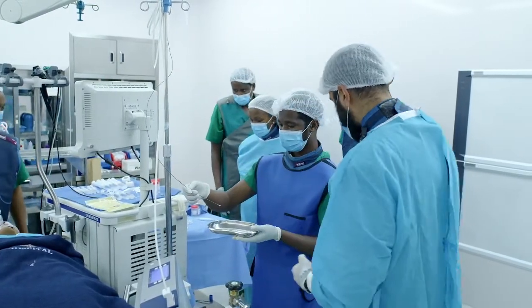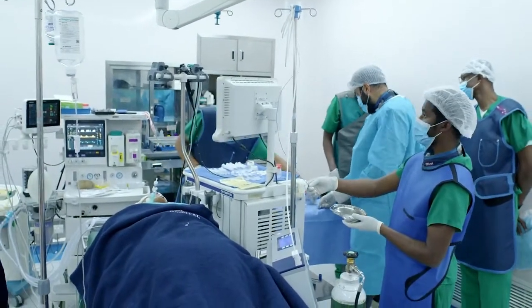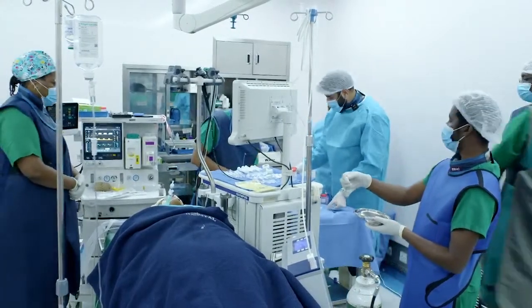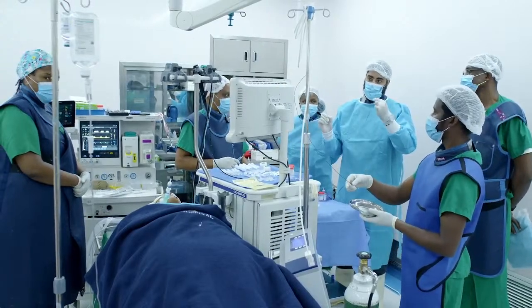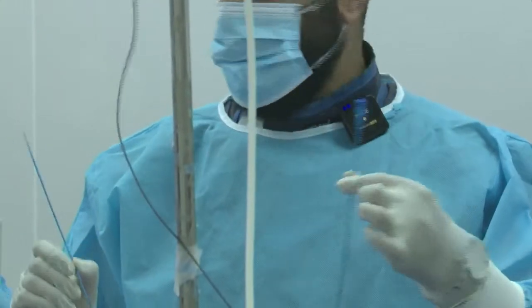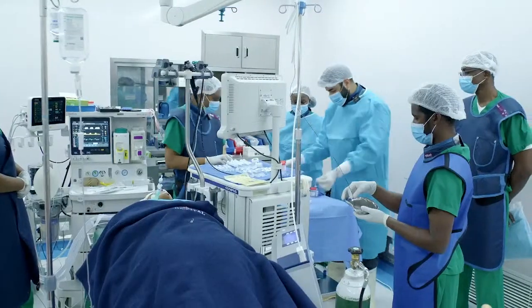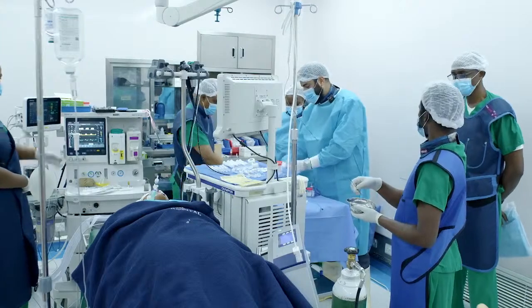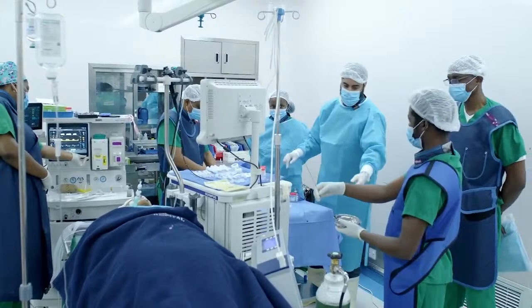Then on this side, this is the rest of the equipment we have. So we've got a balloon here, which you'll see us placing during the procedure. This is a Fogarty balloon. This one has a stylet, so we like this because it lets us get it into the right place. We've tested the balloon again, so I'm not going to retest it, but we'll show you how to place it during the procedure. Then we've got our sample dishes and everything that we need. All the kidney dishes are under here. There's saline, and that's for the sample.